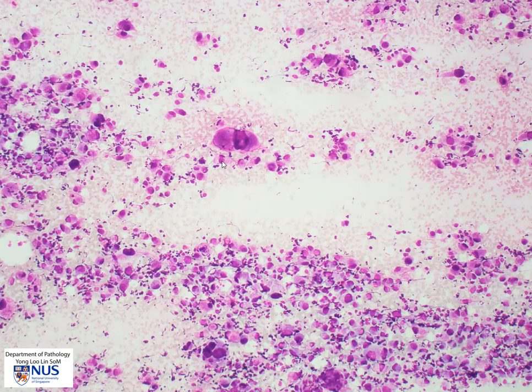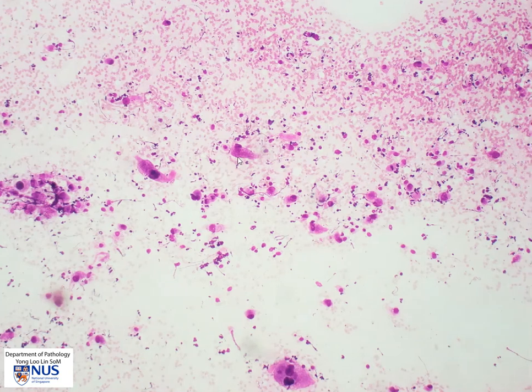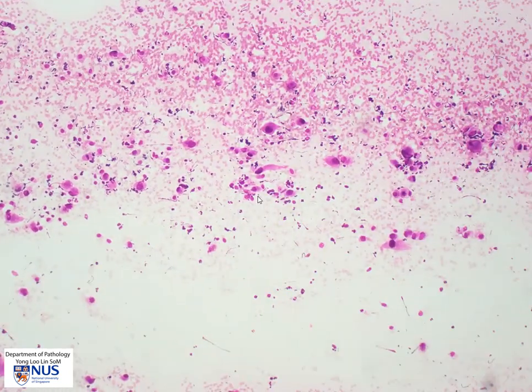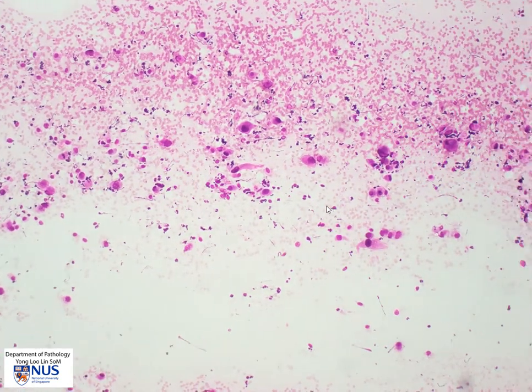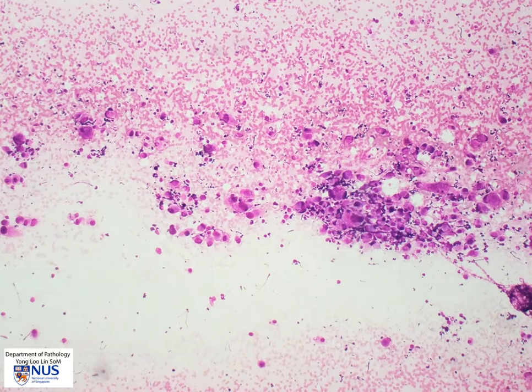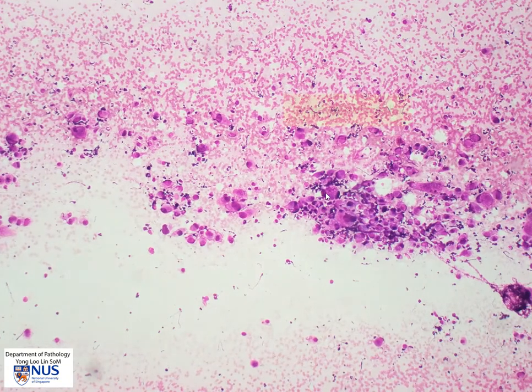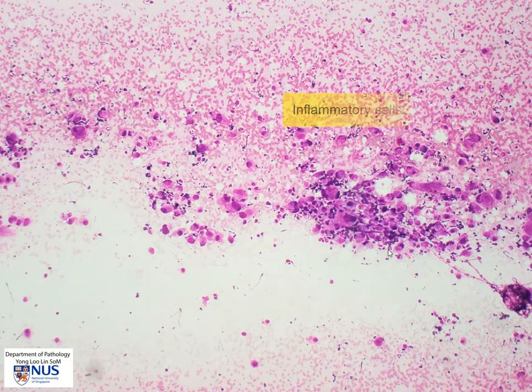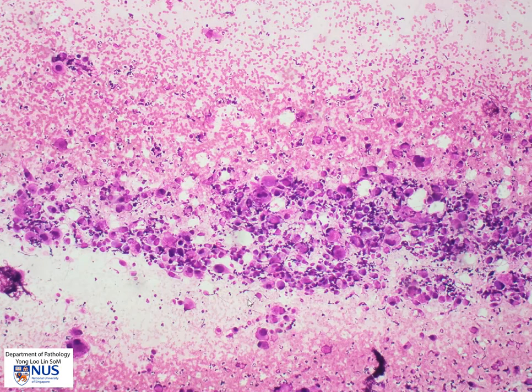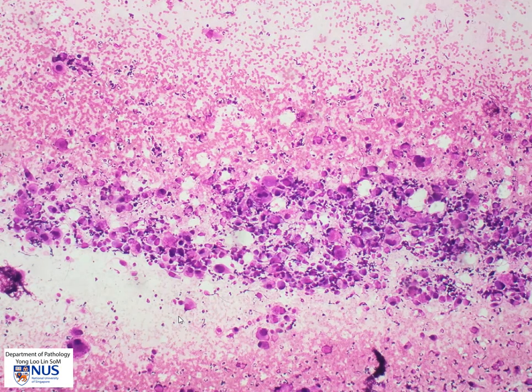Here is another area with very large bizarre cells and at the same time there are other very atypical pleomorphic cells in the background. We also see some inflammatory cells present in the background, which is not an uncommon finding in anaplastic thyroid carcinoma.